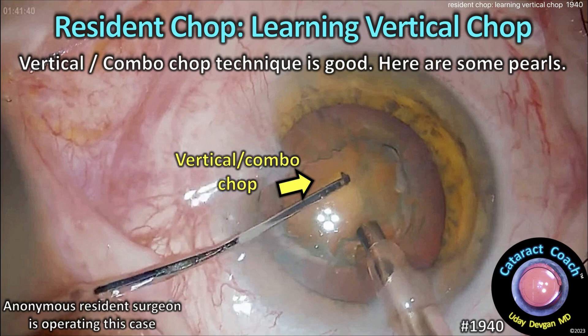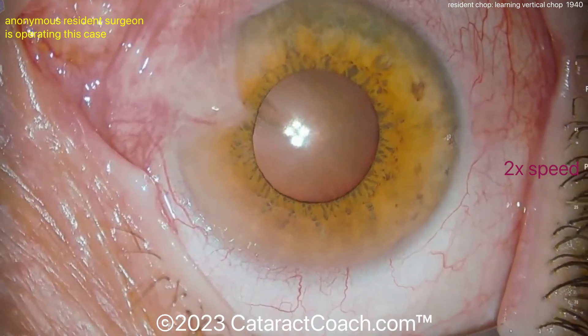CataractCoach.com. Resident Chop — Learning Vertical Chop. This is a vertical slash combo chop technique, and here are some good pearls.